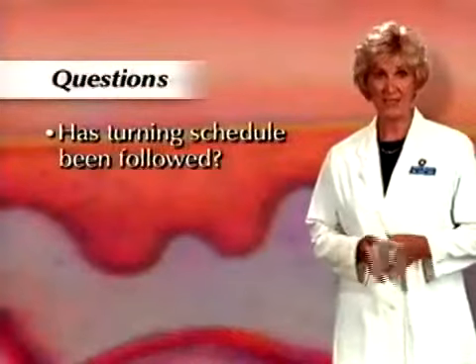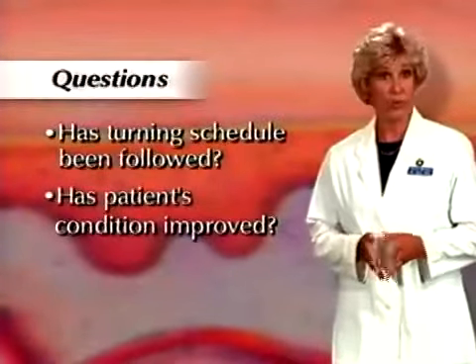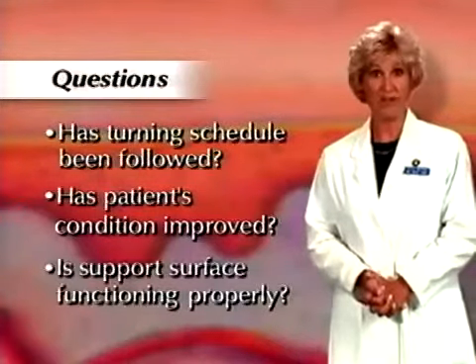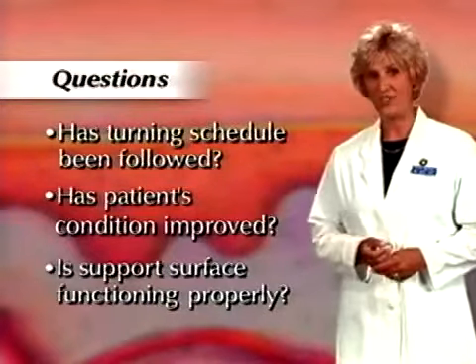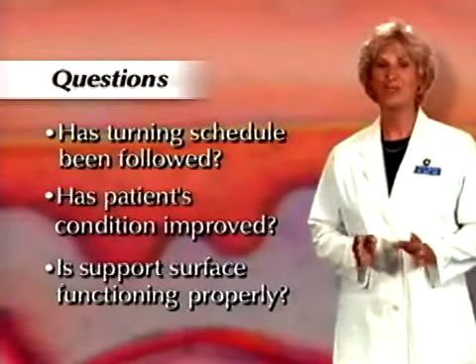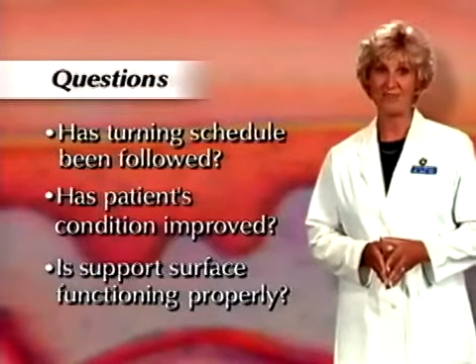Has the turning schedule been followed? Has the patient's medical condition improved or stayed the same? Is the support surface inflated and functioning properly? Check it by hand to assess its inflation. If you answer yes to these questions, then try upgrading the support surface. And be sure to document your evaluation, recommendations, and outcomes.